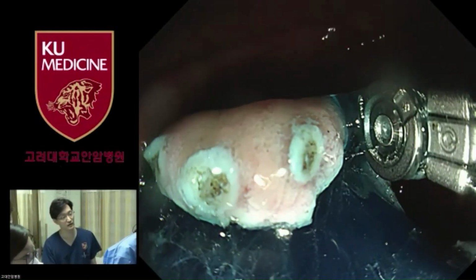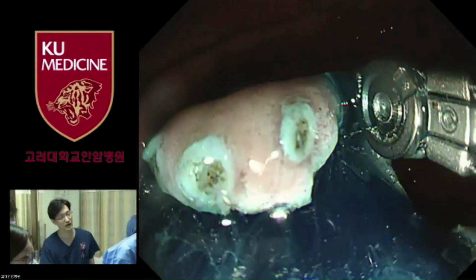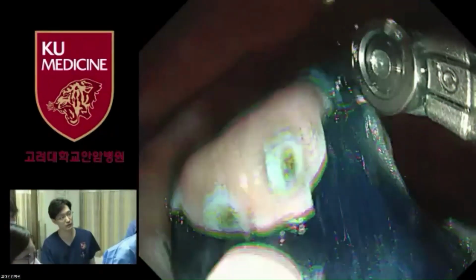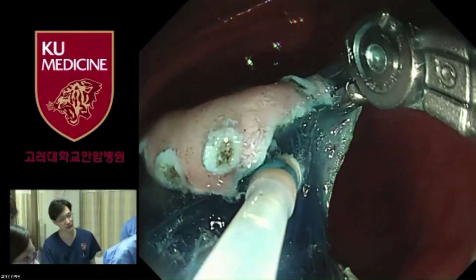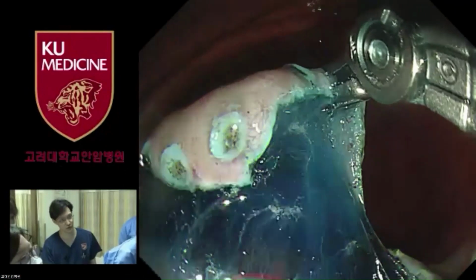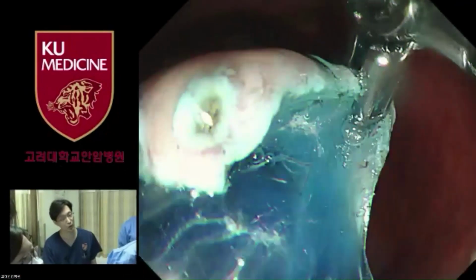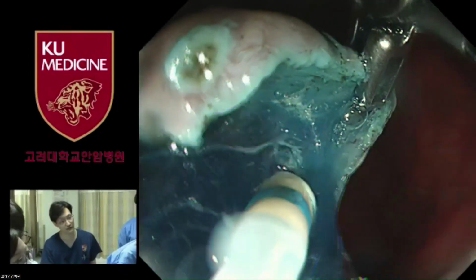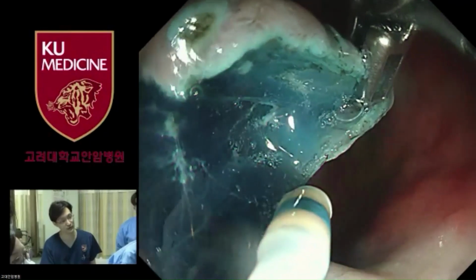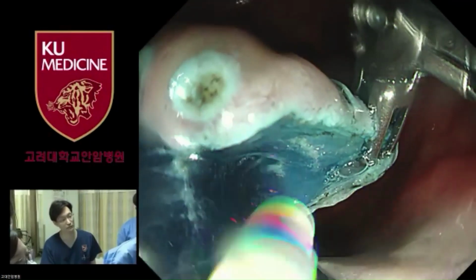But in terms of exposing the submucosal layer, and also reducing the blind type dissection, it works. As you can see, we can expose the whole operation field by lifting up the mucosal flap, and we can see the whole field, and also we can make our own dissection plane.